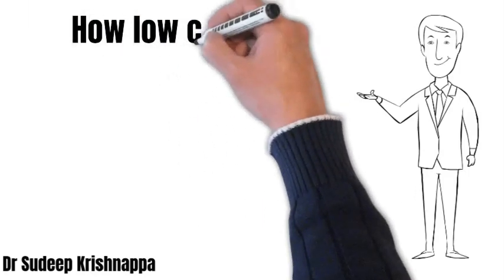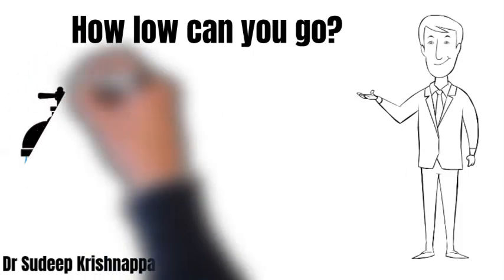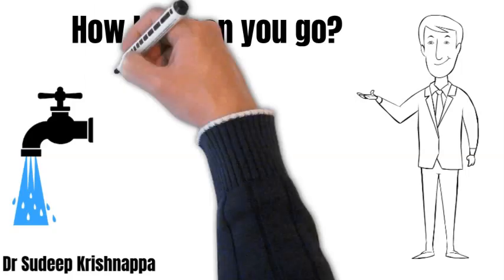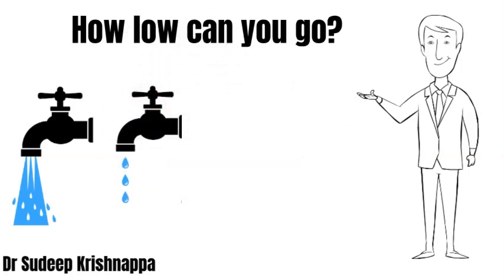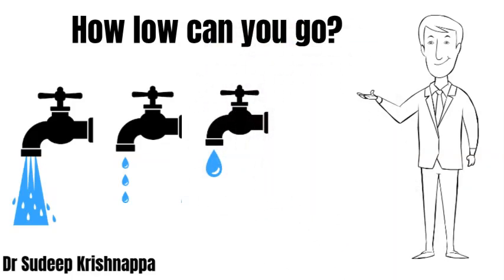Not having access to these advanced workstations is not the end of the road. Having had all the three prerequisites, namely the willingness to practice low flow, a decent anesthesia workstation, and a gas monitor, we can still practice low flow. How low a flow on the fresh gas can you go down to? Is it an arbitrary number?